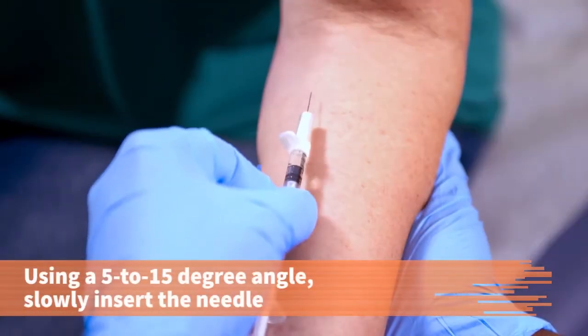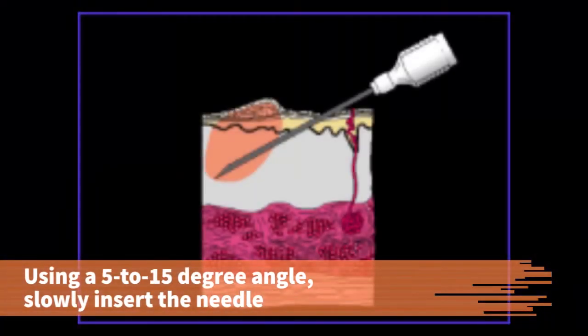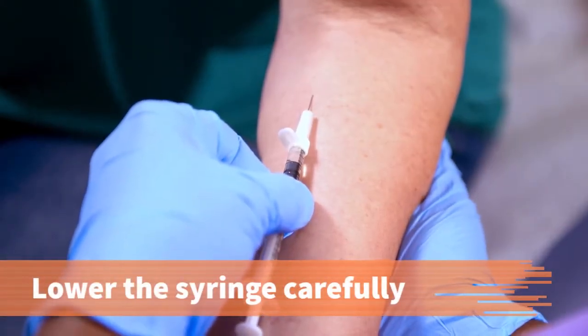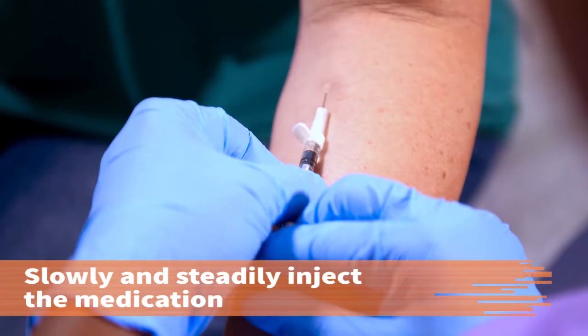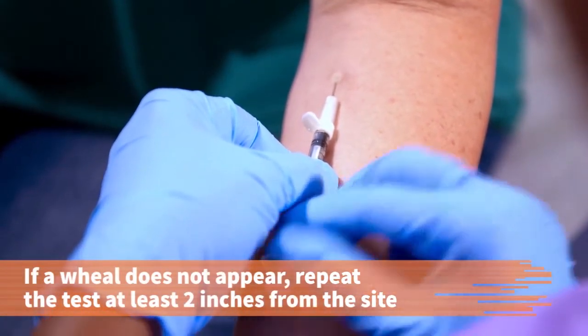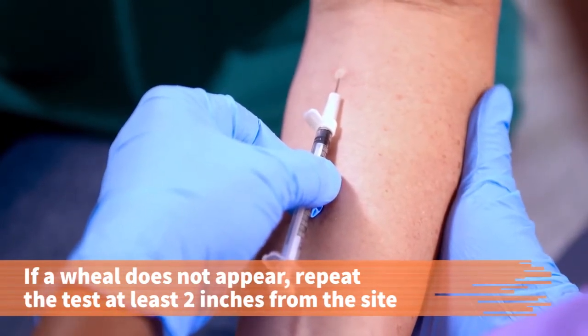With the bevel up and using a 5 to 15 degree angle, slowly insert the needle until the bevel is covered with skin. Carefully lower the syringe to the skin and hold it steady with your dominant hand. Move your non-dominant hand to the plunger. Slowly and steadily inject the medication by pressing on the plunger. If a 6 to 10 millimeter wheal does not appear, repeat the test at least 2 inches from the site.